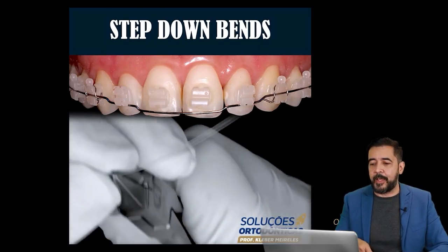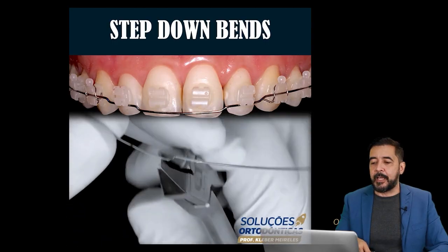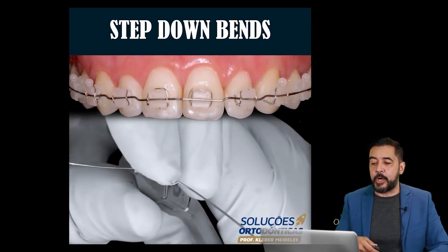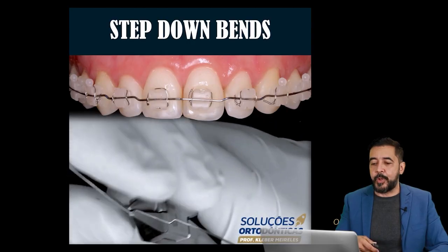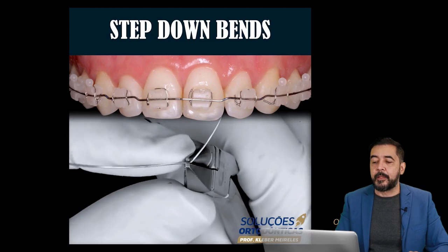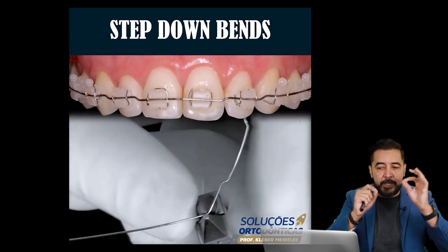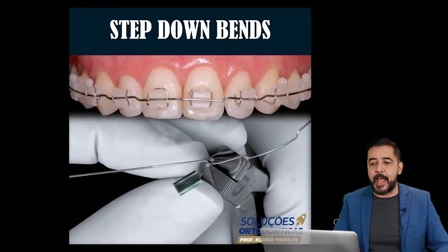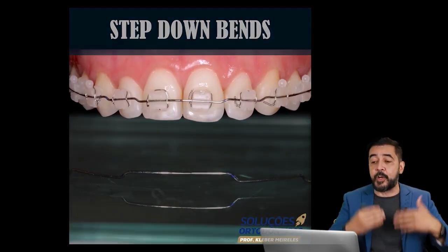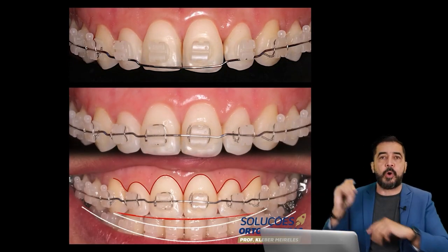But now, just for an example, I'm going to show you these step down bends. They are made in order to have that beautiful smile arc. So we can do that both by means of bonding at the beginning, different heights of the incisor brackets, or if you want to change or even increase that step, you can do that in the course of your treatment.